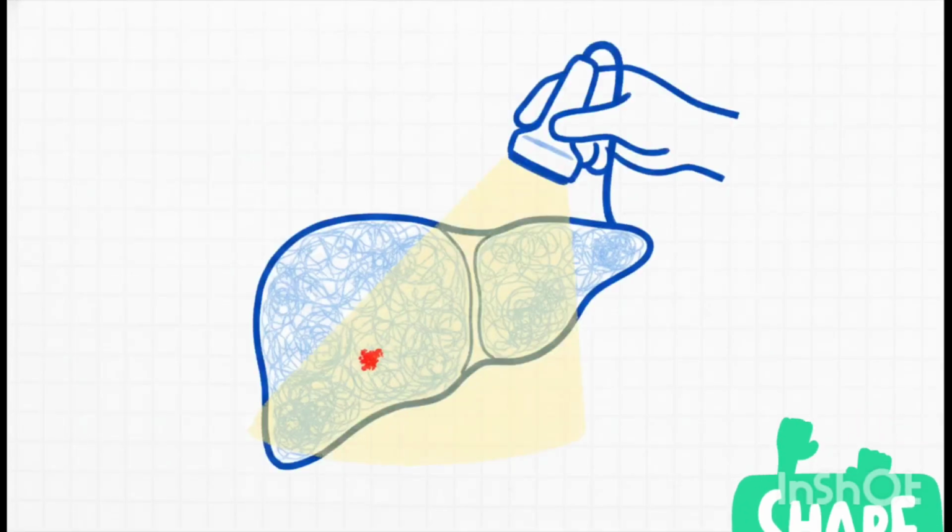And this brings us right back to why we actually do this. Running through that 6-point checklist isn't just some academic exercise to help you pass your exams. It is about real, tangible patient outcomes. Early detection helps diagnose liver disease before serious complications develop. Catching a grade 1 fatty liver or spotting a tiny irregular mass early simply because you knew exactly what baseline deviations to look for, that is the true power of ultrasound.